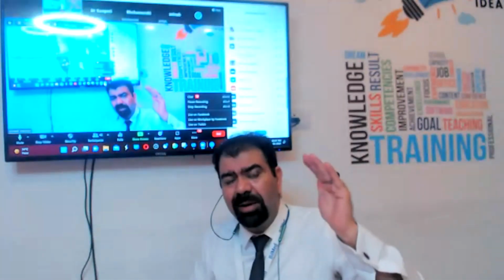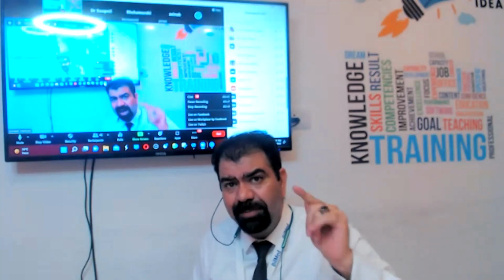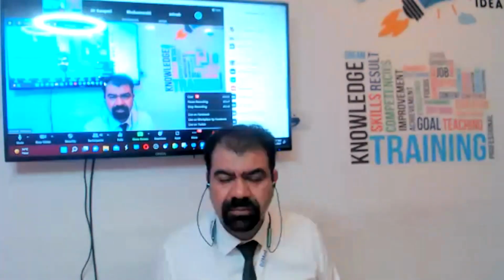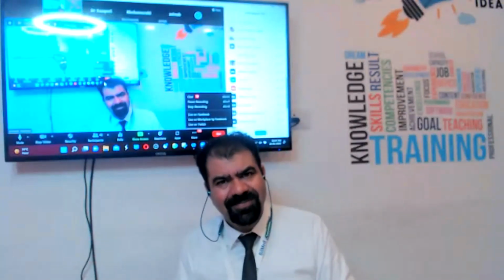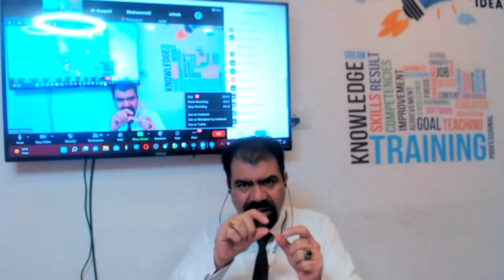Will you expect a 12 millimeters or a 14 millimeters endometrium in that particular case where the patient has expelled out everything? No, sir. Will you expect even an 8 millimeters endometrium over there? No, sir. How much should the endometrium be if everything has expelled out? It should be around 5 millimeters. Very good. It means it has to be maybe less than 5. Because in early stages, the endometrium is very thin.